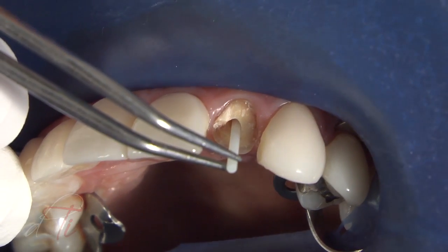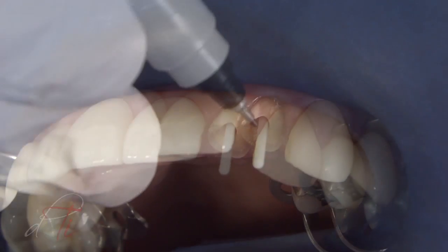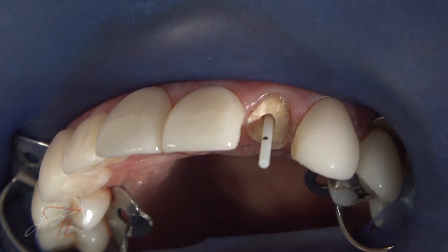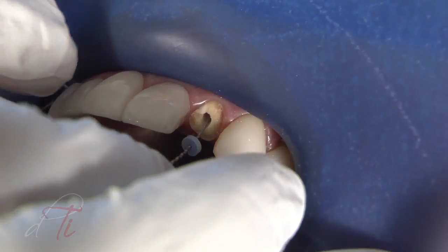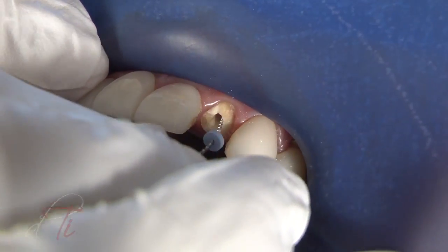The pre-selected Rebuilda fiber post is placed into the post channel and the coronal height is measured and indicated with a fine point marker to the desired length. The proper orientation is verified by rehearsal of the post placement. The canal walls are then inspected for any residual cement and gutta percha with a number 35 endodontic broach.